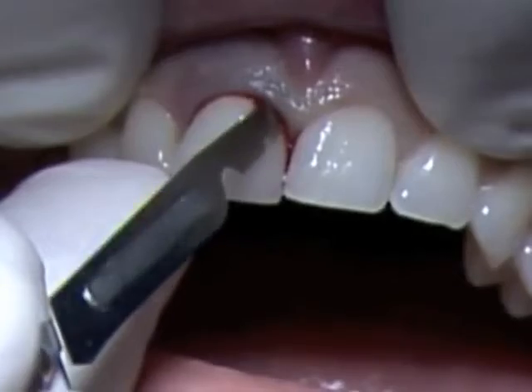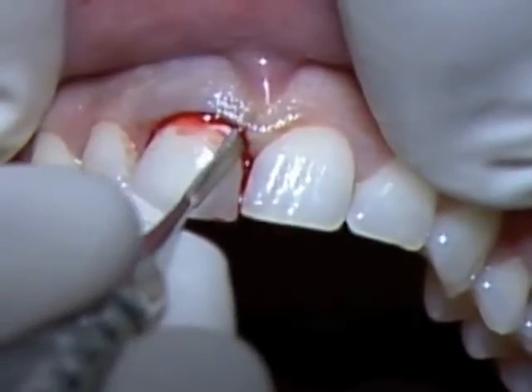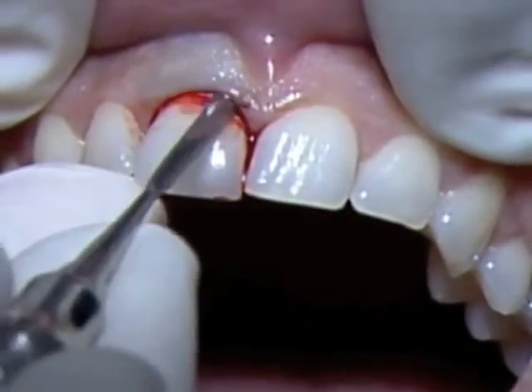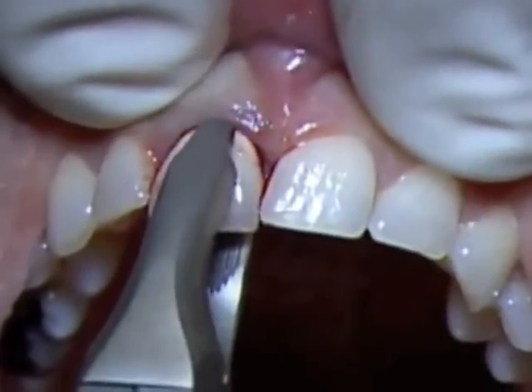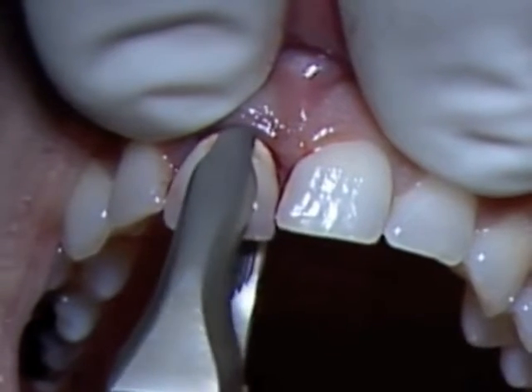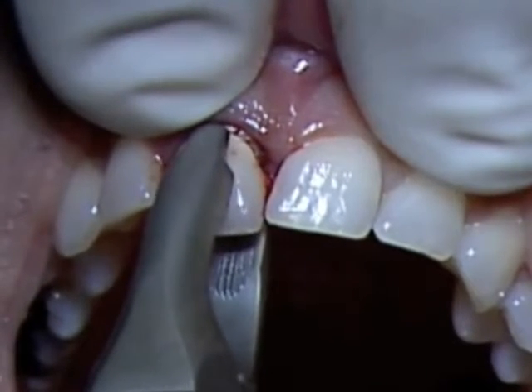We will then use a thin periotome to mobilize a bit further apically and also determine where the level of the bone is. After we have completed, we will use our forceps with elliptical round movements in order to extract the tooth without damaging the buccal plate.